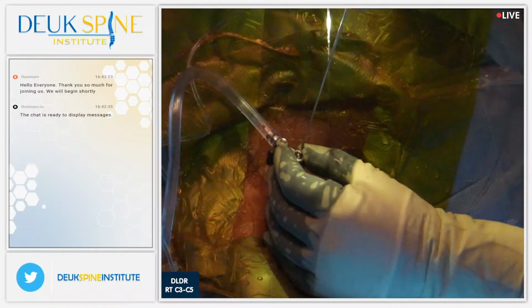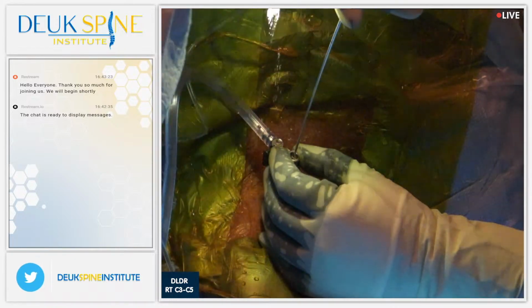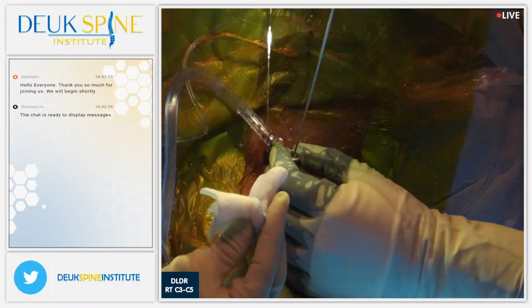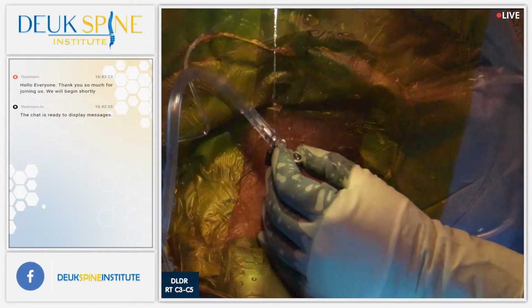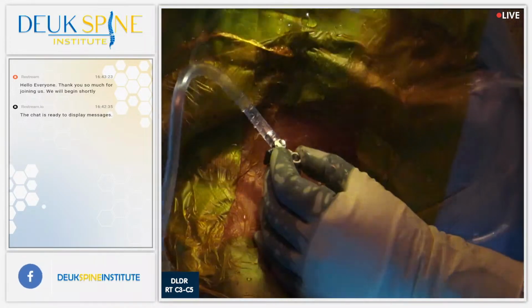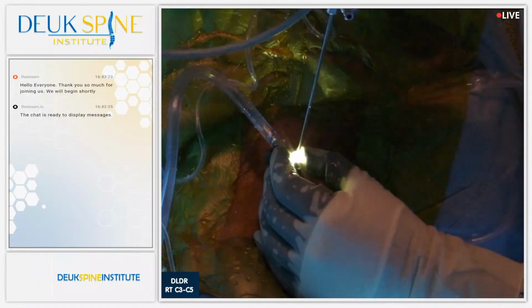I don't think I got it. Don't let that blue wire hang down low.